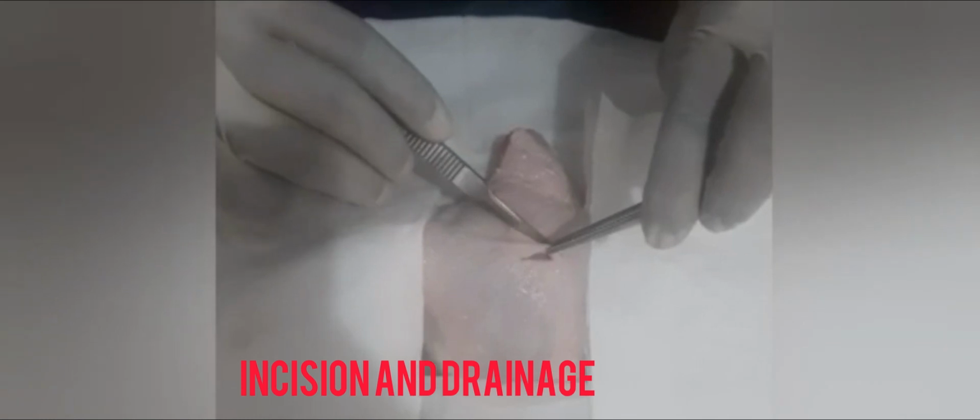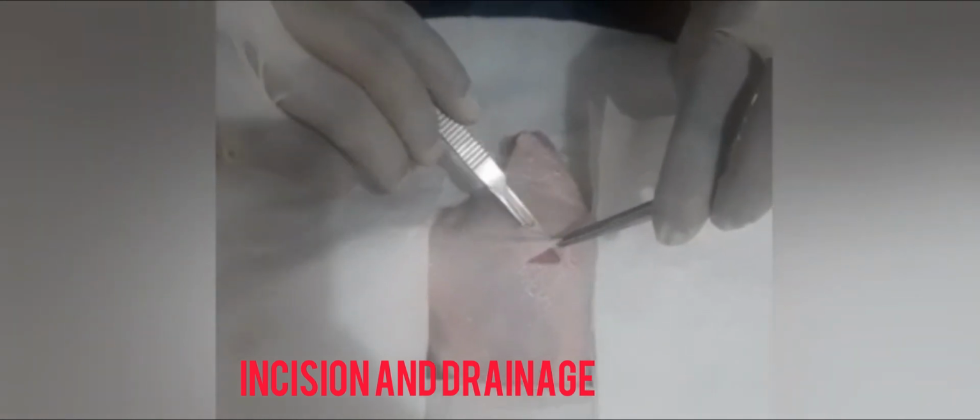For the elliptical incision, use a dissecting forceps to secure the skin tag or the tissue in place as soon as we go through with the incisions. Carefully cut through the edges of the skin tag.